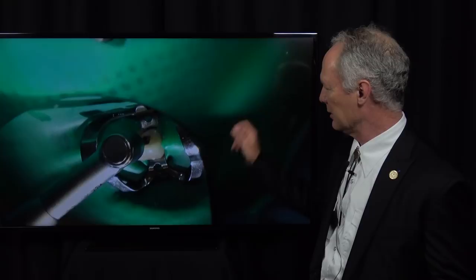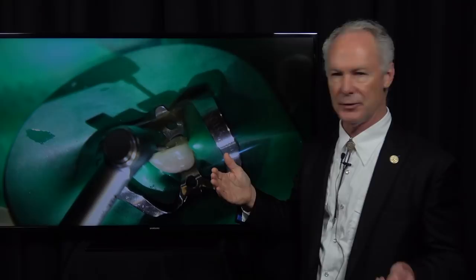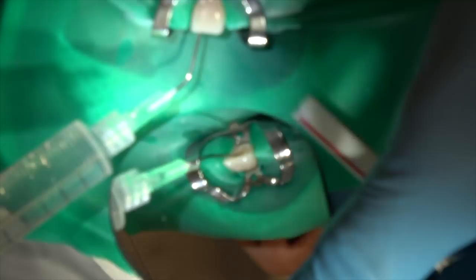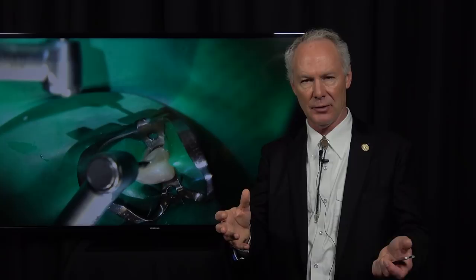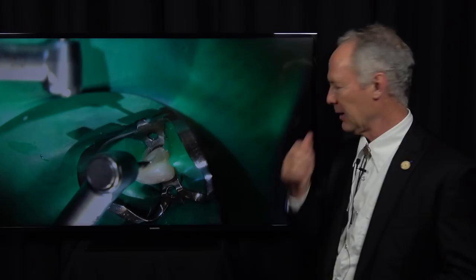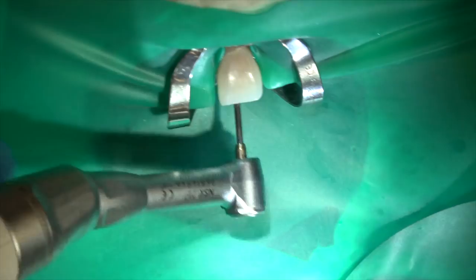Remember, don't put any pressure in the canal with the tip of the syringe holding the sodium hypochlorite. Just let it fill the canal up and then anything in the canal will float to the top. Then I'm coming back and cleaning again — no pressure. Then irrigating again. No pressure with the tip of the syringe. You just want to fill it up and let everything float to the top. Then I go back and drip a little in the chamber so the chamber and the canal are full of sodium hypochlorite, and my assistant doesn't aspirate that second drippage away. Then come back with the file and just clean it real well.